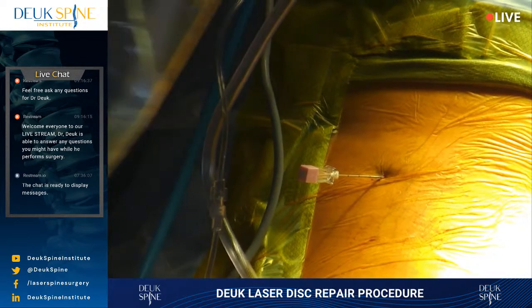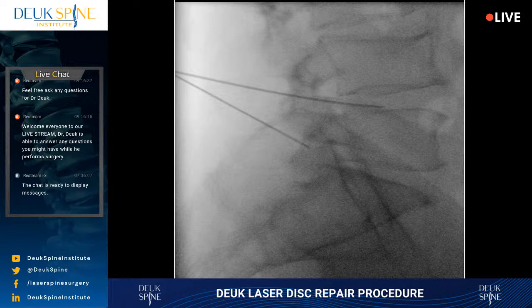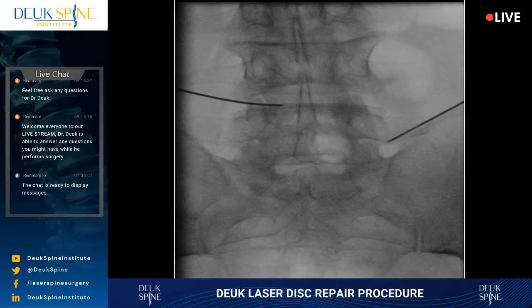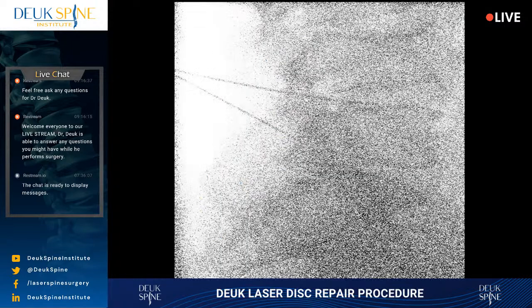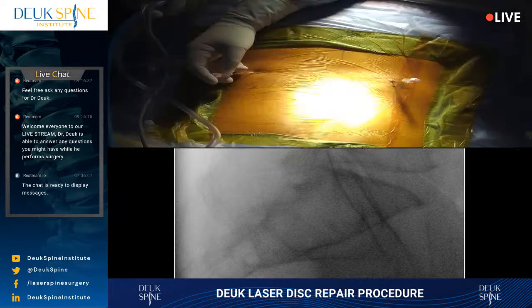L5-S1 is the hardest disc to access with this technology, transforaminal. So for those of you watching the surgery, you're watching the most state-of-the-art surgery in the world to treat herniated disc, bulging disc, degenerated disc, all three. And bulging discs are really the same as a herniated disc, just a small herniation. And degenerated discs are the same as a herniated disc, but over time, the inflammation that goes on in the disc causes destruction of the disc.